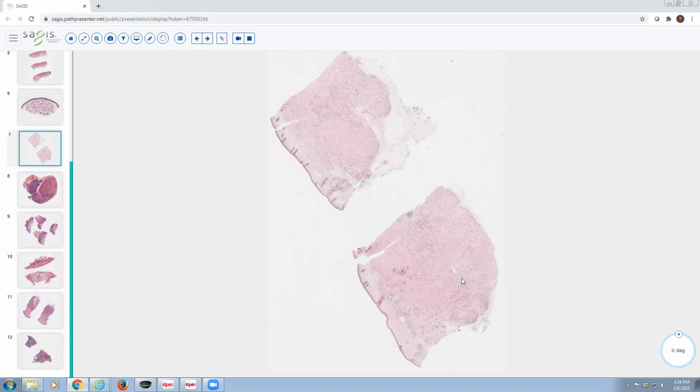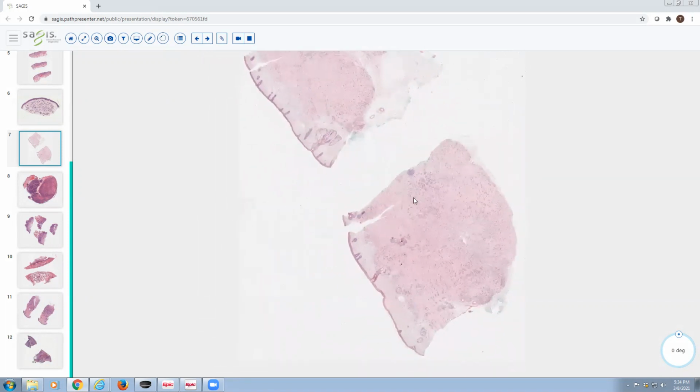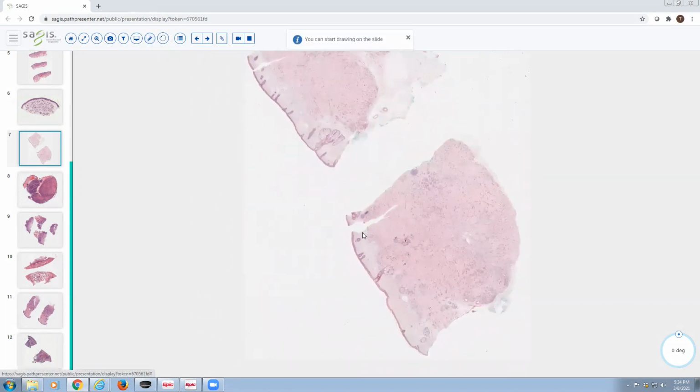We're on scanning magnification here, and we have a punch biopsy, which reveals this tumor to be deeply situated and also just extending deeply. So this is a punch biopsy, and the tumor goes all the way to the base of the punch, and also side to side. So you can't comment or make any observations about architecture here.